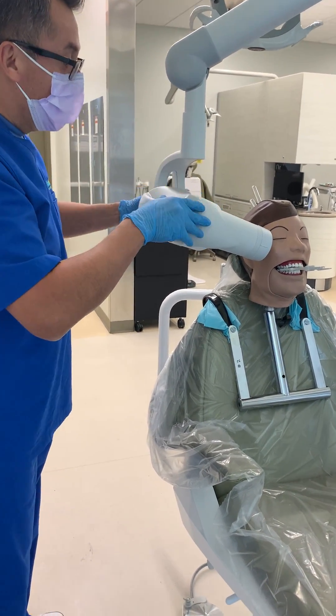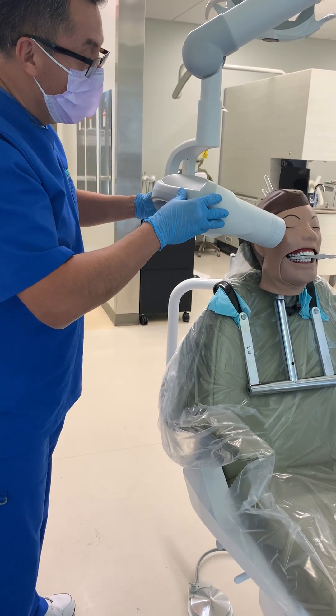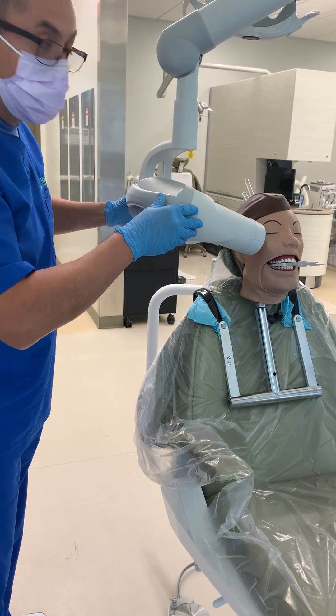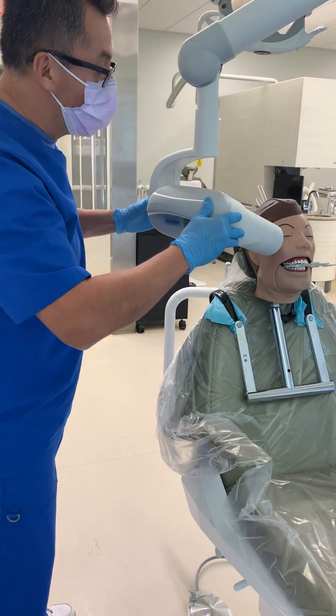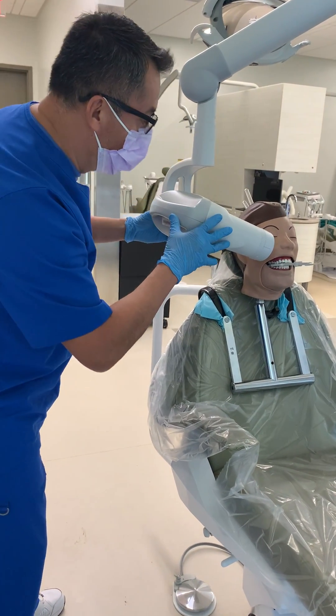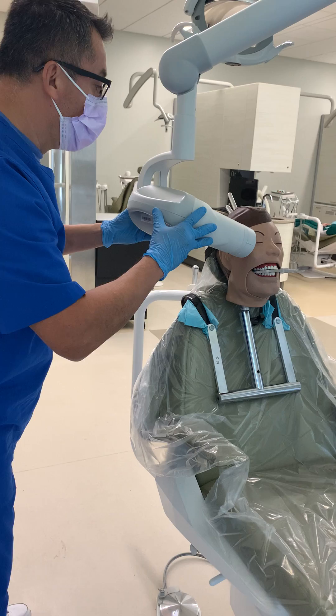So you have to do a small adjustment with what's called a horizontal angulation. That means you're going to tilt the PID slightly. Too much of this will cause overlapping, and not enough will cause overlapping as well. So we're going to tilt a little bit.